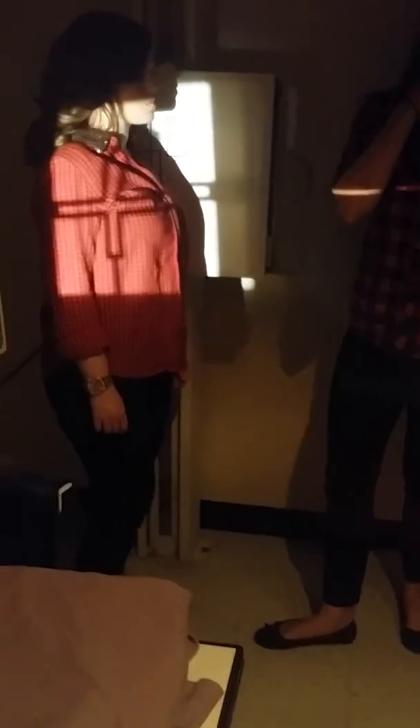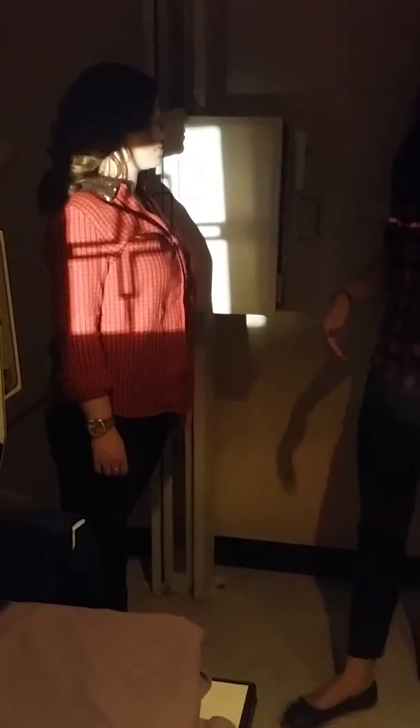Then you go into your lateral — it's always left lateral. So if you know you got the top of it on your PA, I wouldn't move this up and down at all.